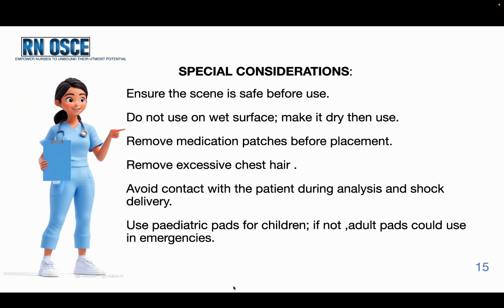These are the special considerations for AED use. Ensure the scene is safe before operating the AED. Avoid using the AED on a wet surface. Dry the area before use. Remove any medication patches from the chest prior to pad placement. You are requested to shave or remove excessive hair to ensure good contact with the pad.